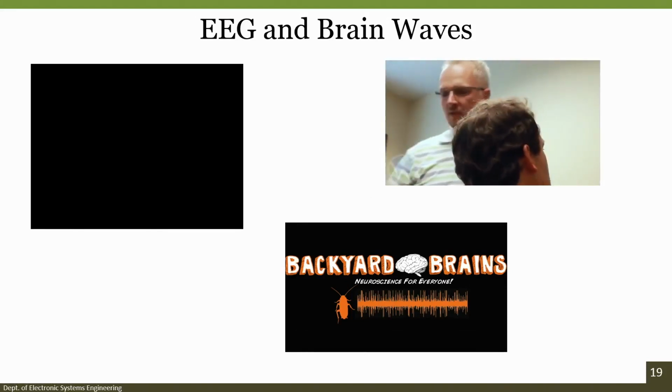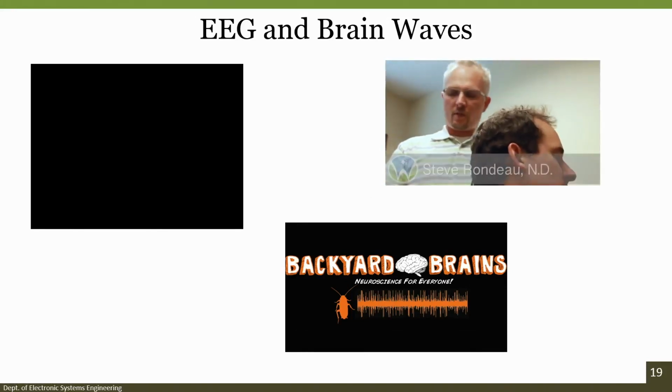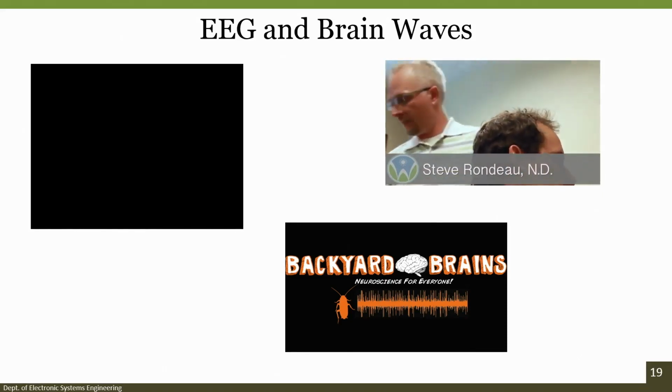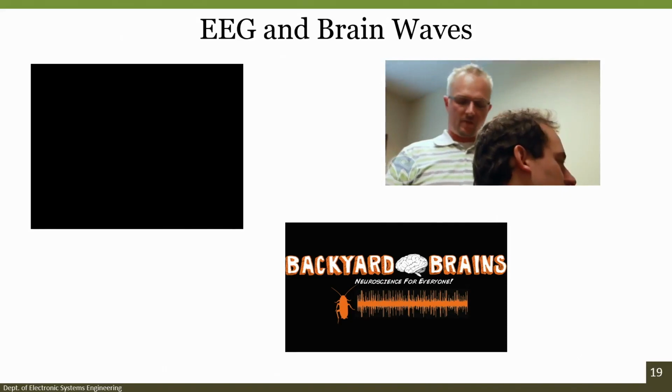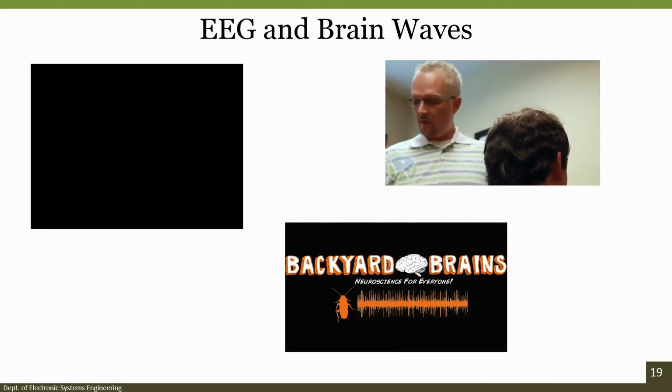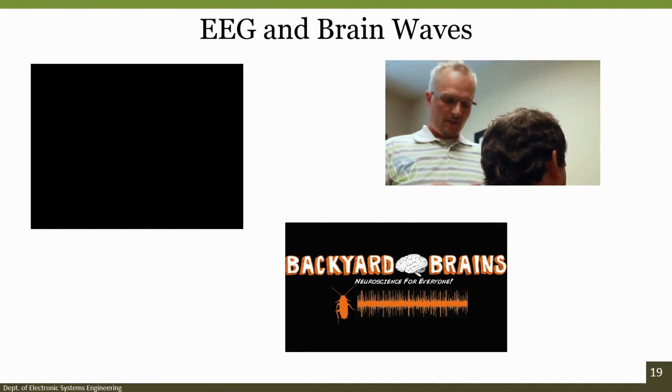So we're going to be recording your EEG today, and so essentially what we're going to do is put this swim cap over the top of your head. It doesn't have any feeling associated with it or any encumbers. It's just a pretty easy process. Okay. Put these little foam sponges on these here. And now the cap will go over your head.